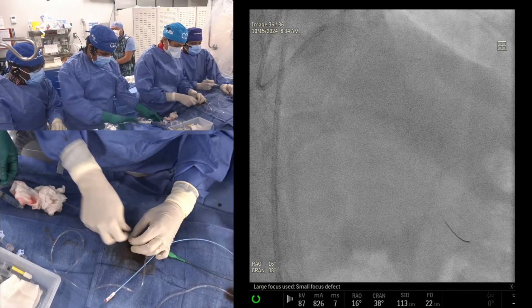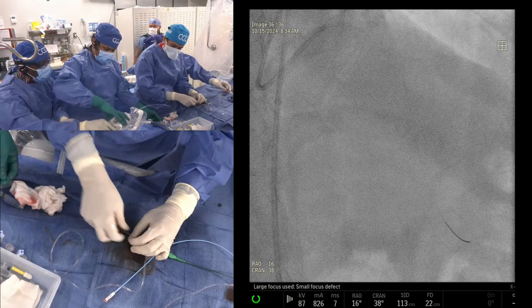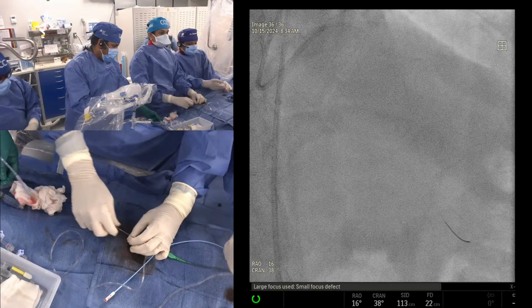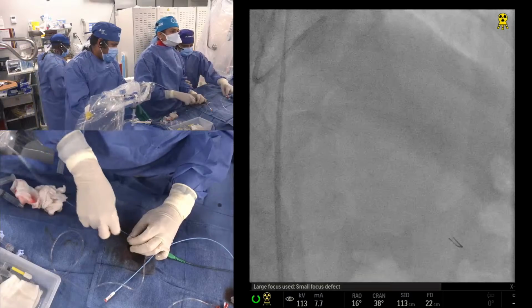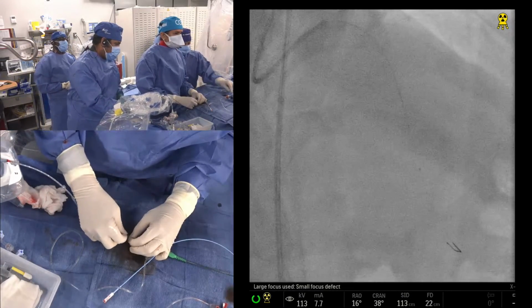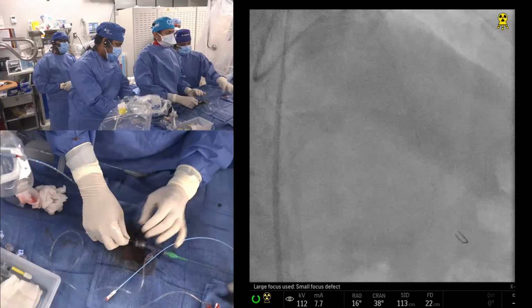Okay, closer. Andrew has the slide ready of the wire. Show the IVUS on the screen. Samin, what is the longest CTO you have done in terms of exposure to the patient?